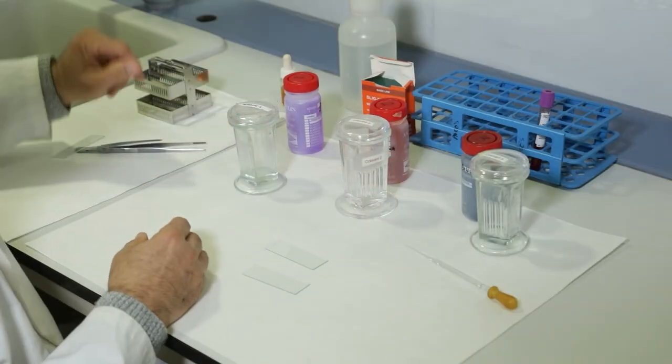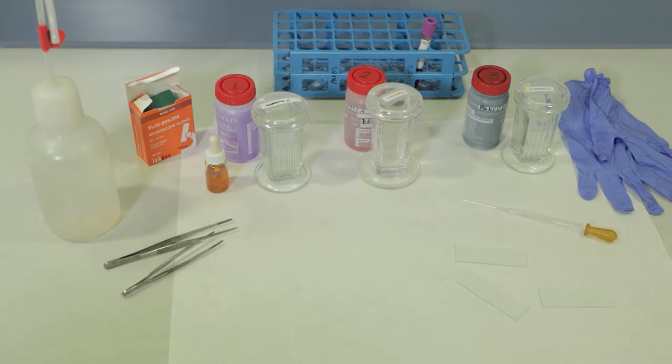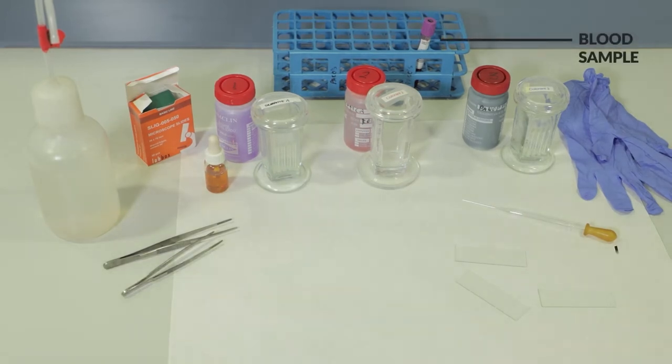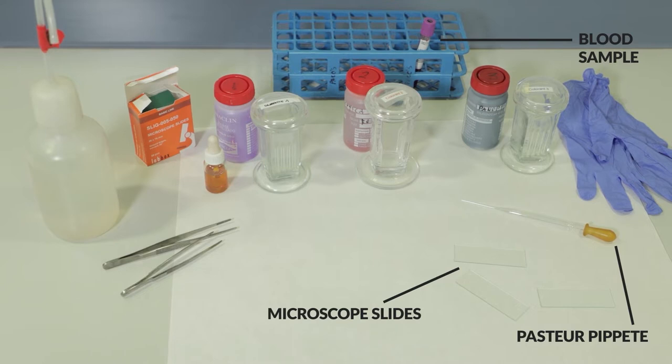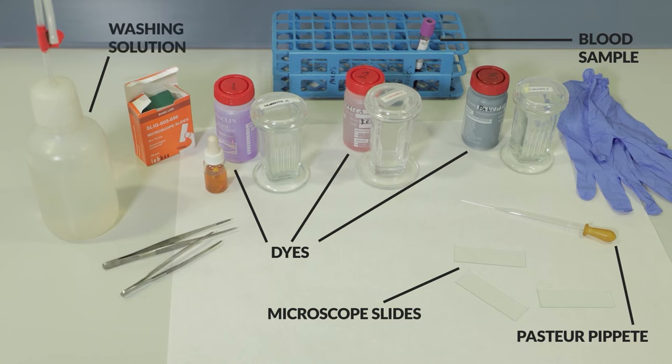Required material. To conduct the frotis, the following material is needed: blood sample, Pasteur pipette, microscope slides, dyes to conduct a differential staining of the blood samples, washing solution, and tweezers.